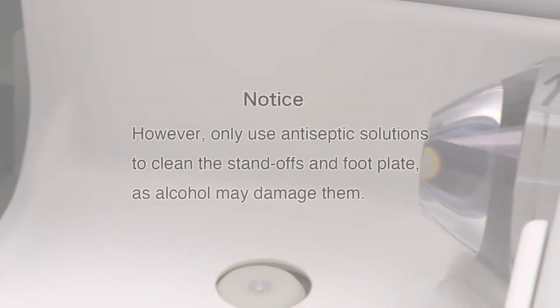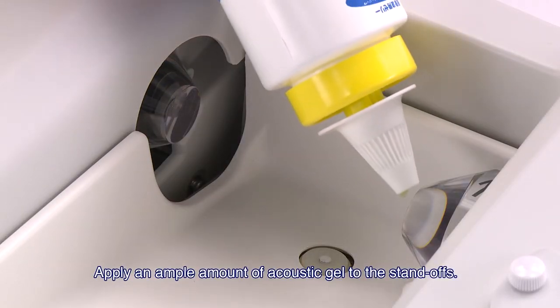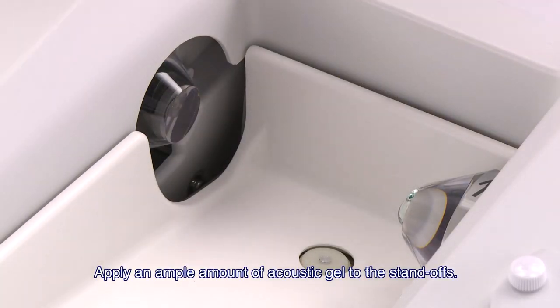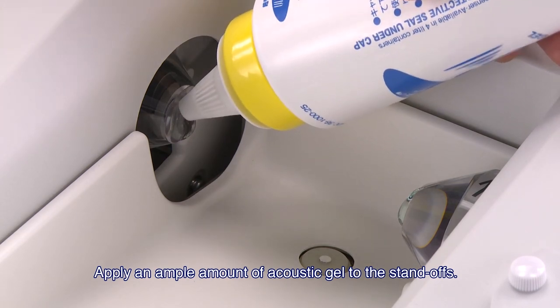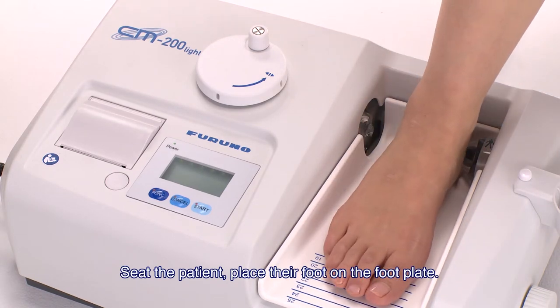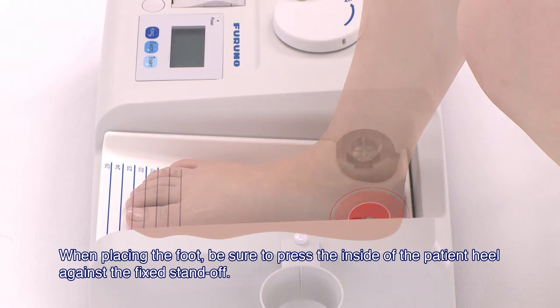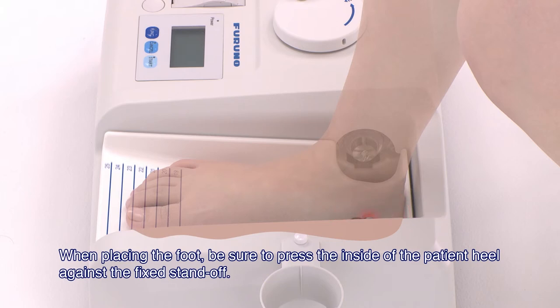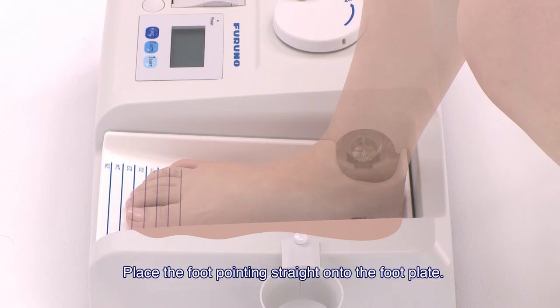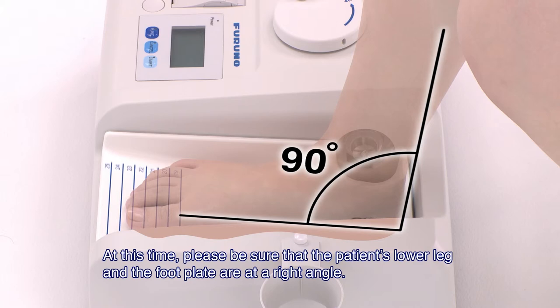The aim is to remove skin surface oils and allow clear ultrasound transmission. Please wipe the area carefully. However, only use antiseptic solutions to clean the standoffs and foot plate, as alcohol may damage them. Apply an ample amount of acoustic gel to the standoffs, taking care not to drop the gel onto the unit. Seat the patient, then place their foot on the foot plate. When placing the foot, be sure to press the inside of the patient's heel against the fixed standoff. Place the foot pointing straight on the foot plate. Please be sure that the patient's lower leg and the foot plate are at a right angle.